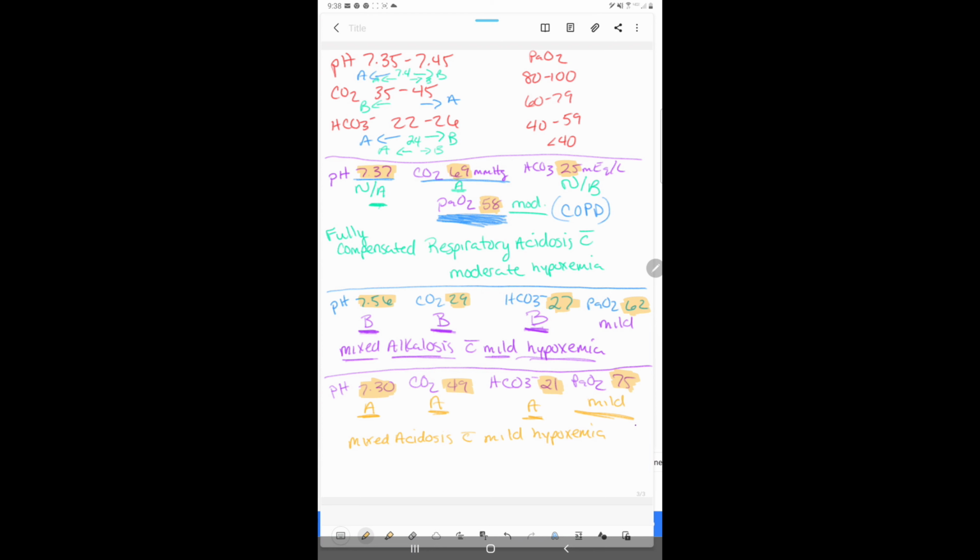I guess there could always be a chance you could see it in the clinical setting somewhere. But in two years, I have never seen a blood gas like this, even looking at other patients that other students had and trying to help them interpret their blood gases. So it's just something you could probably see in the classroom.